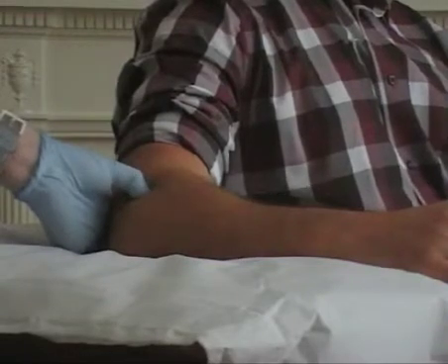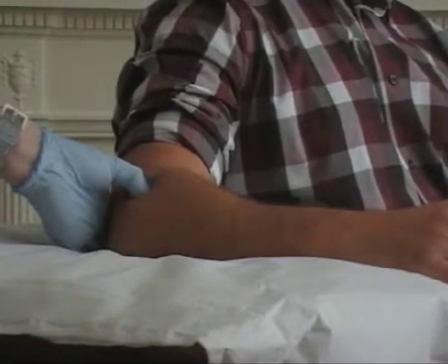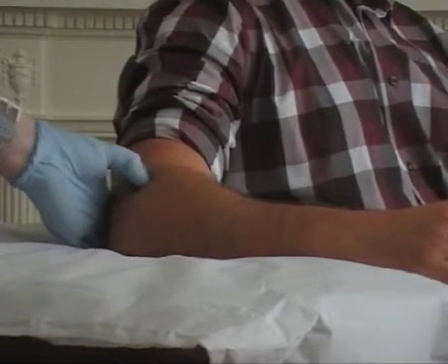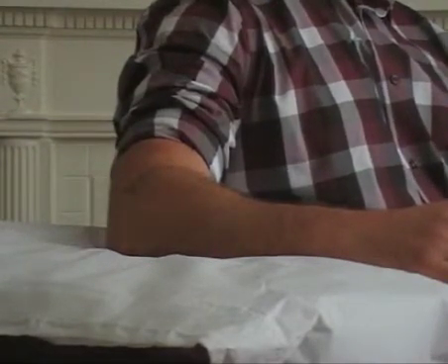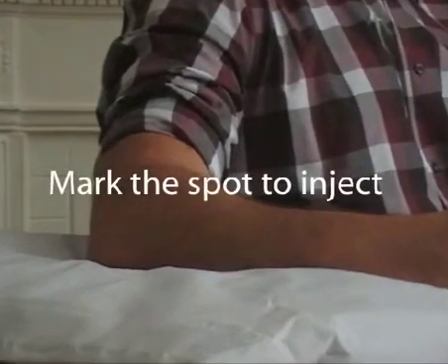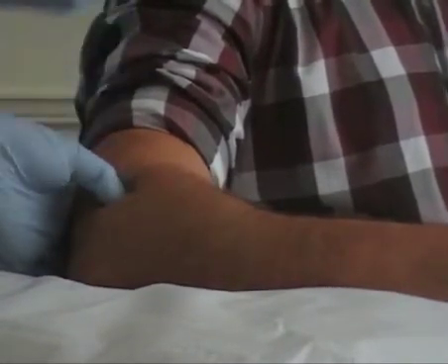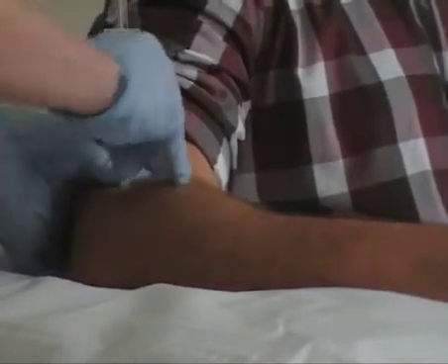Once we've located the common extensor origin, I'm just going to demonstrate how you would approach marking the patient and injecting the needle. Firstly you need to select a needle which is an appropriate size for the patient. When you actually come to administer, you need to clean the skin, but we're just going to mark the patient now onto that common extensor origin that we found with the needle sheath, so we can mark that point.